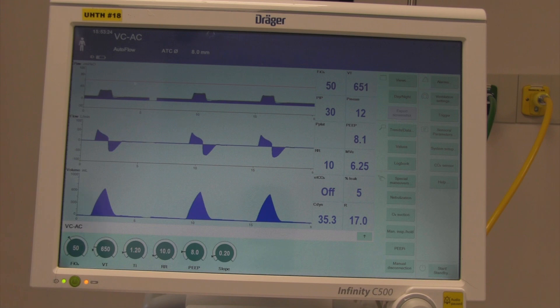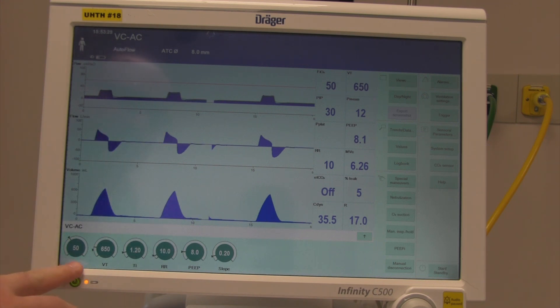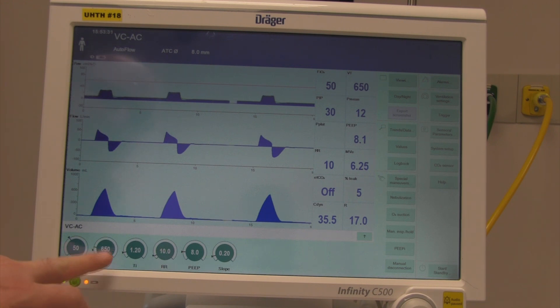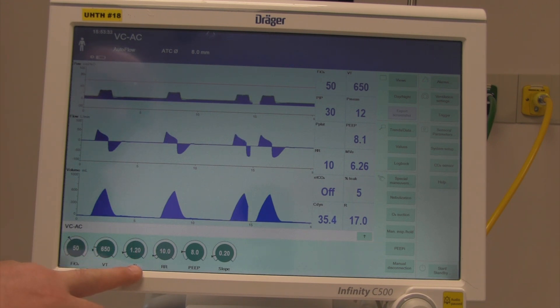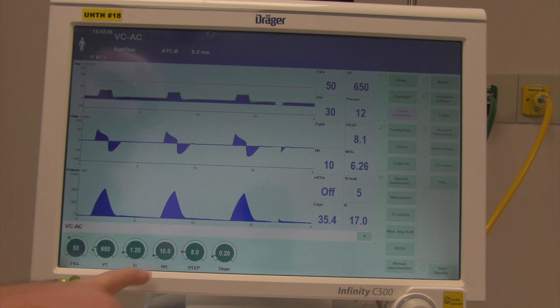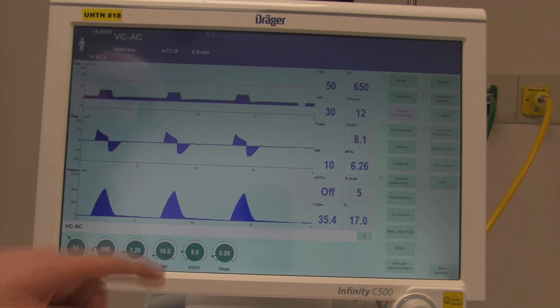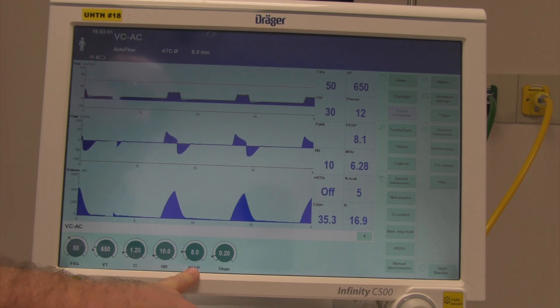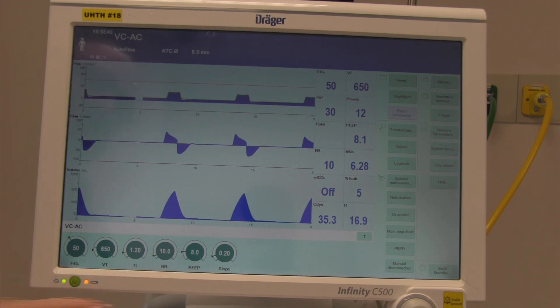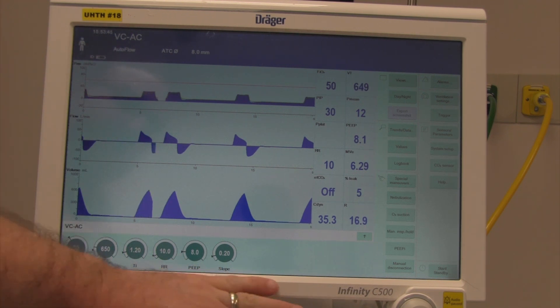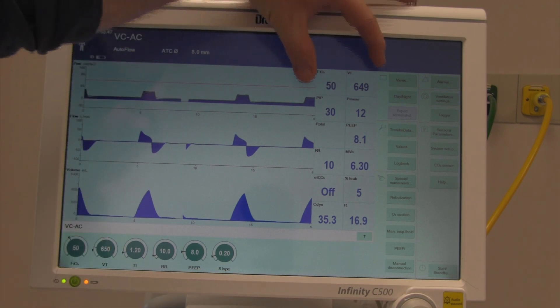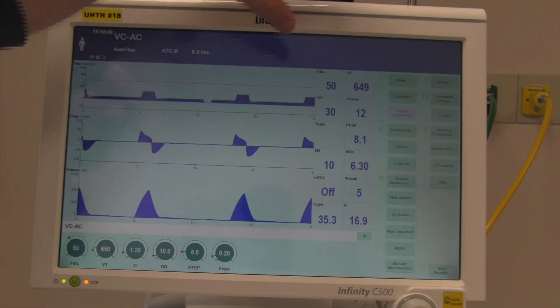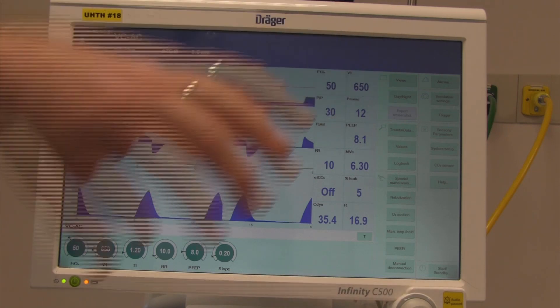I've got the Draeger V500 set up with some generic adult settings. We have 50% FiO2, a tidal volume of 650, a Ti of 1.2, respiratory rate of 10 — which is clinically low but I'm using a test lung — PEEP of 8, and a slope of 0.2. Across the bottom are my settings; over on this side are the patient values showing what the patient is currently doing.